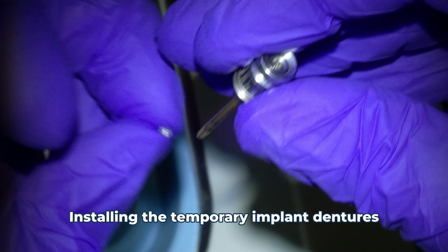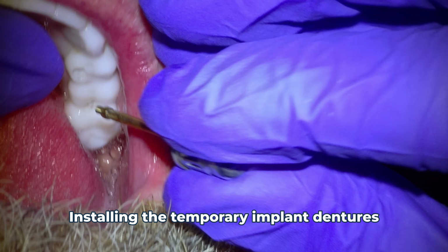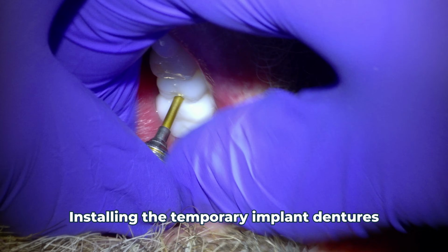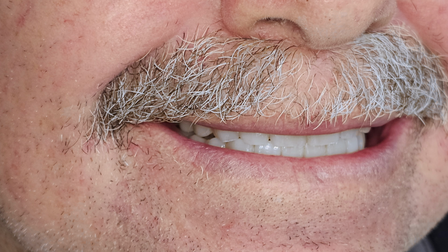And another note, sometimes things can be sore for a few weeks after you do these. We hope that that's not the case, and those are kind of the two downsides to this procedure on this day. But that being said, these temporary implant dentures always look amazing and are such an improvement cosmetically and functionally right away, even with the provisional implant dentures.